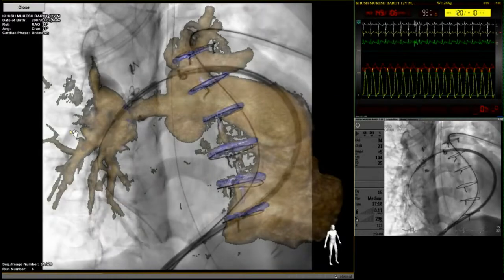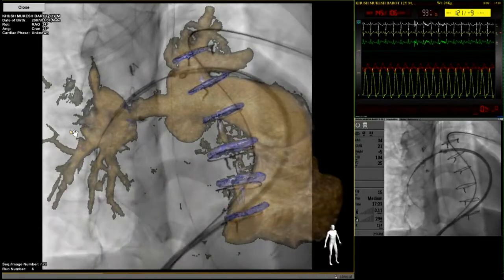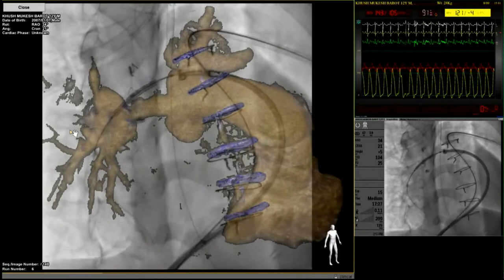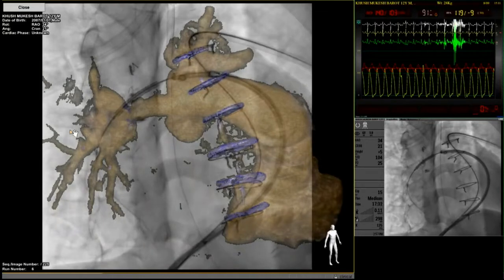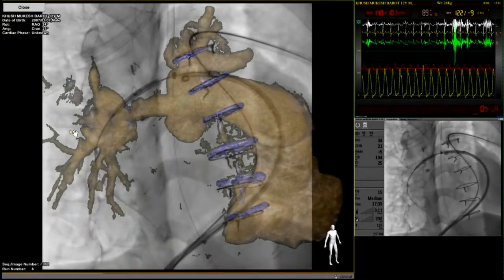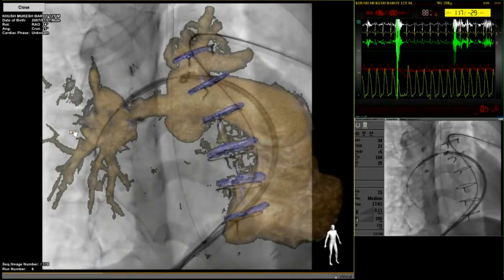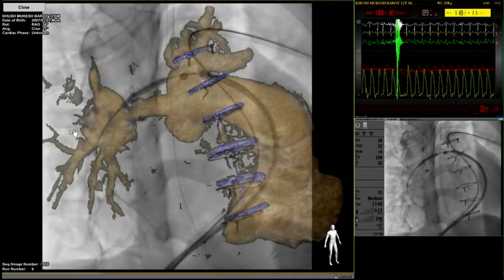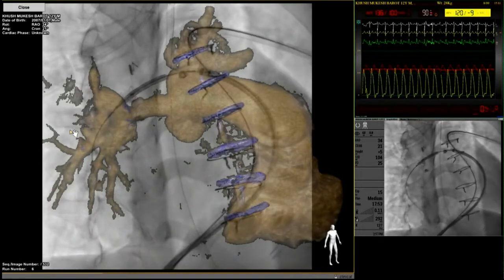So now, sister, I'm actually trusting completely on that right upper lobe pulmonary artery one clip alone. So what I'm doing is, I am pulling back the sheath. I am pulling back the stent marginally. One of the things that we have done is, we have taken right femoral venous access and left femoral venous access. Right is for the right pulmonary artery and left is for the left pulmonary artery, so that there is no confusion about which vessel we are dilating, because when there are two groin sheaths, that doubt will come.